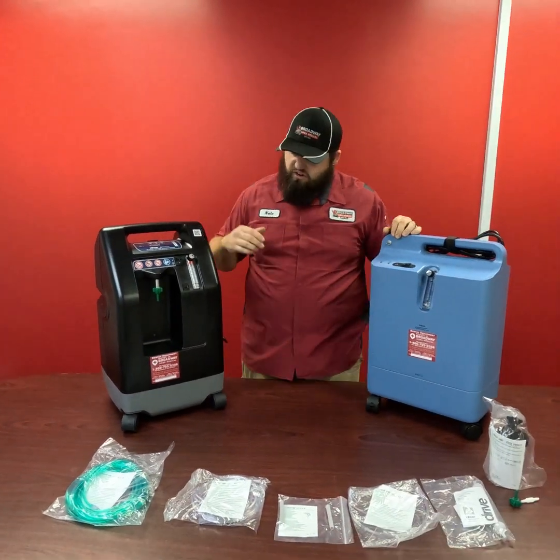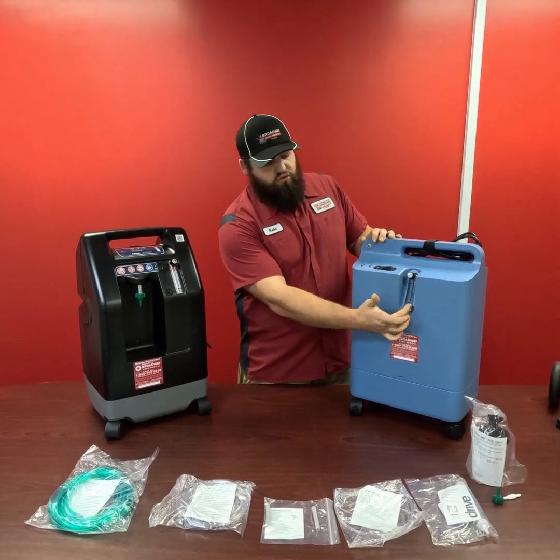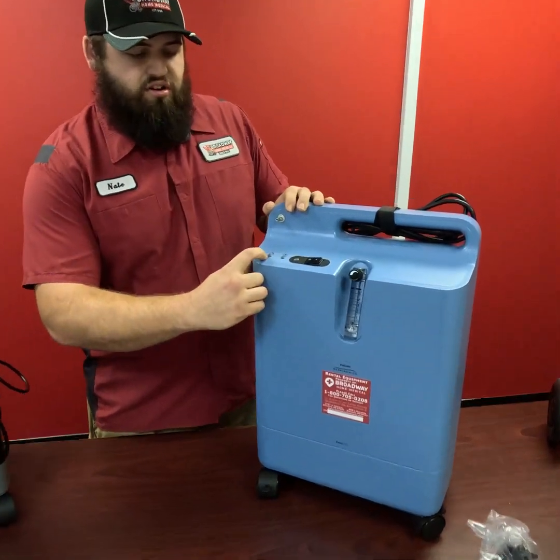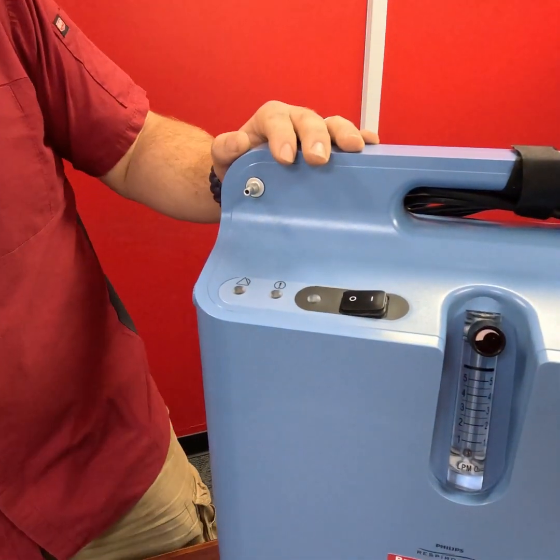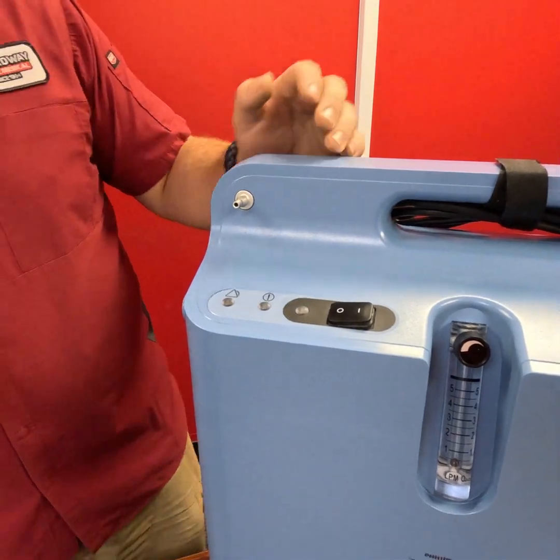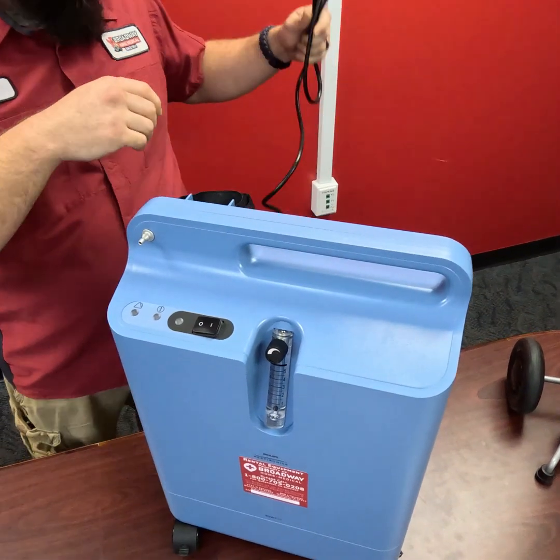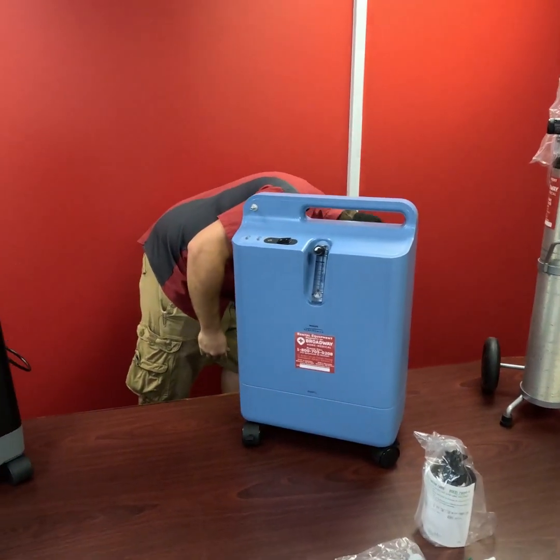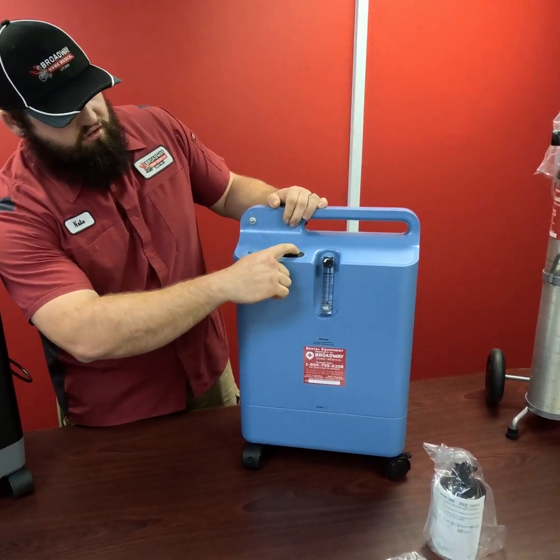So as far as using a concentrator, we have the flow meter, a big power switch, our different lights, and a nipple to set up hoses. So let's go ahead and get this 5-liter plugged in so I can show you just what it sounds like when it is turned on. So let's get this guy going.